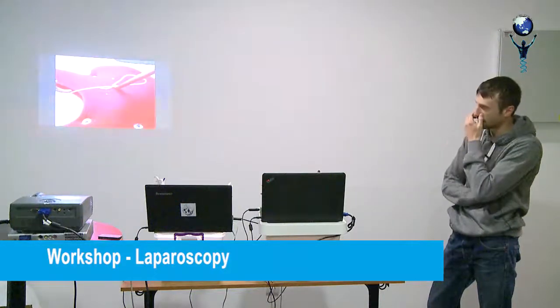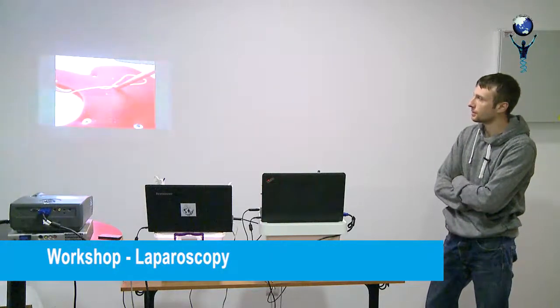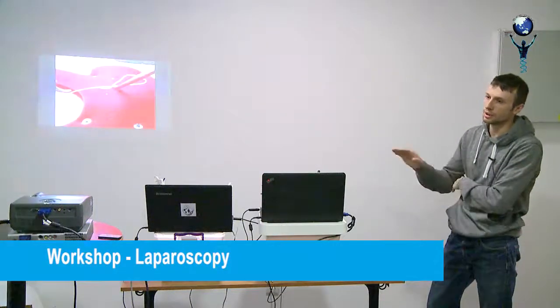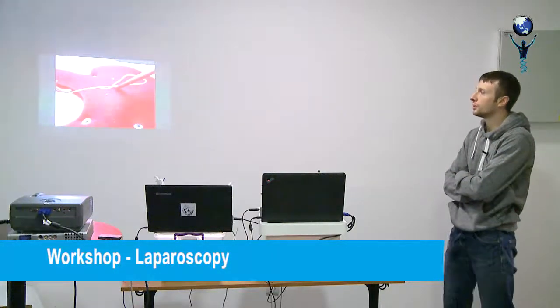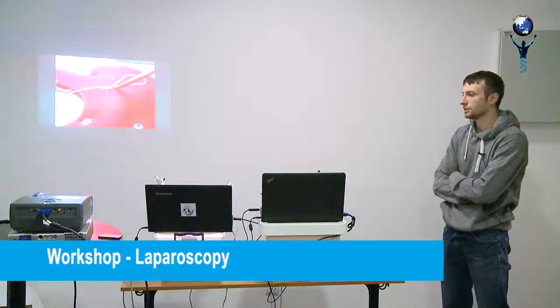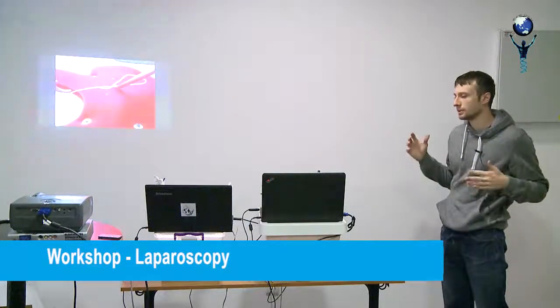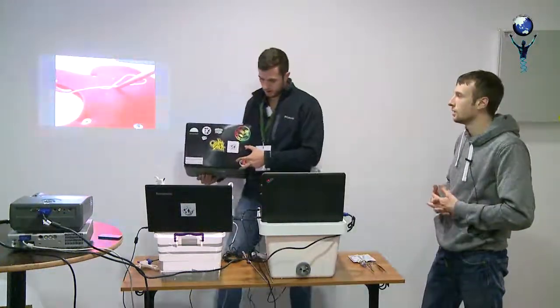So laparoscopic surgery has some difficulties about the step-up learning curve. It's a long step-up learning curve, different from the conventional approach, from open surgery. So first of all, you need to learn to coordinate your, the term is hands-eye. You're looking at a different place from where you're working.